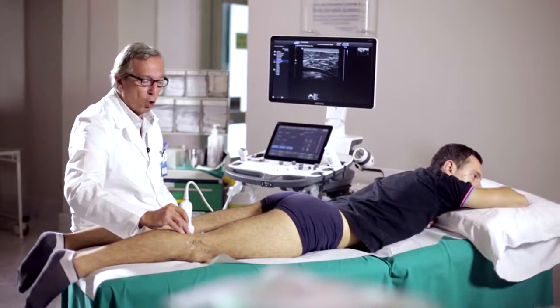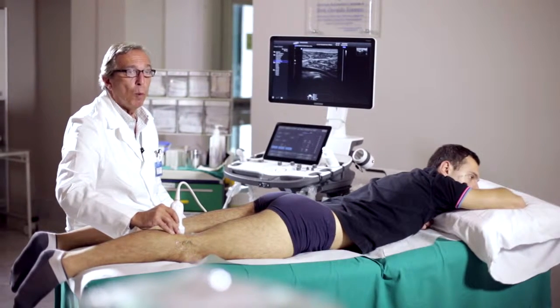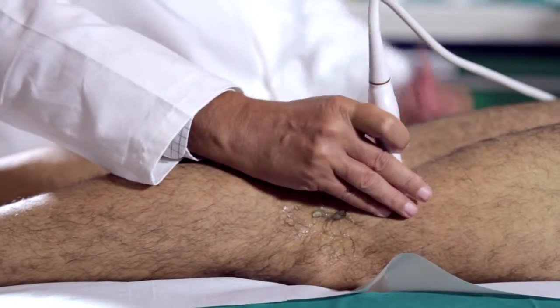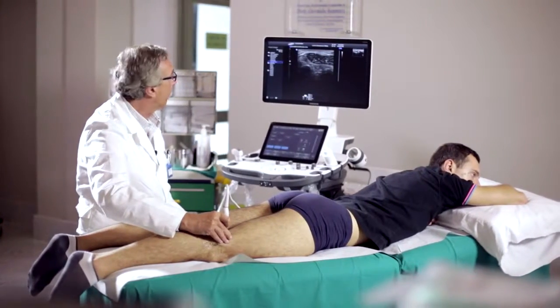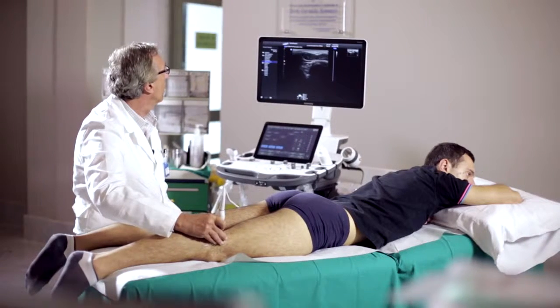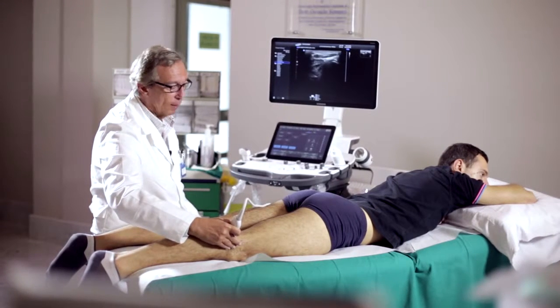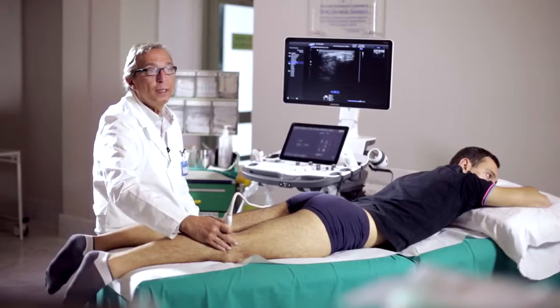A very important ultrasound scan of the posterior compartment is of the external sciatic popliteal nerve. This is a peripheral nervous branch which has a very close relationship with the head of the fibula. The scanning is done using a posterolateral approach, and we see how the probe has to be positioned to assess its presence and to follow it to the point where it leads above the head of the fibula and finally rotates anteriorly. With this scan, the ultrasound examination of the knee is complete.